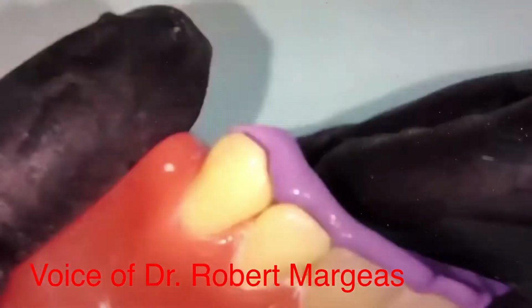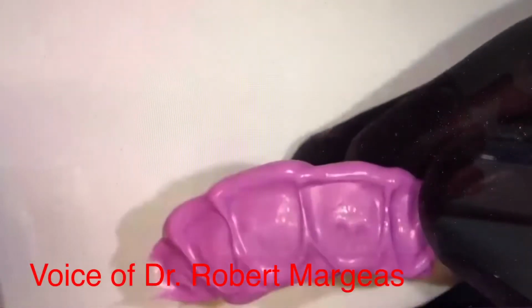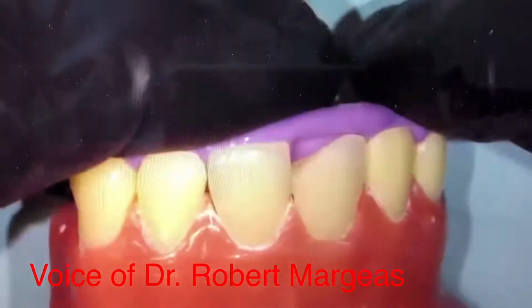Okay, so that seems to be ready. I can go ahead and peel this off, and now I have my lingual matrix. Now that we've got our lingual matrix ready to go, what I want to do is this.